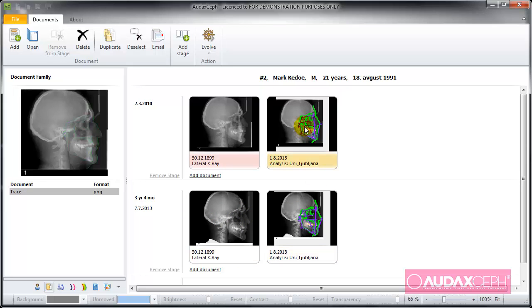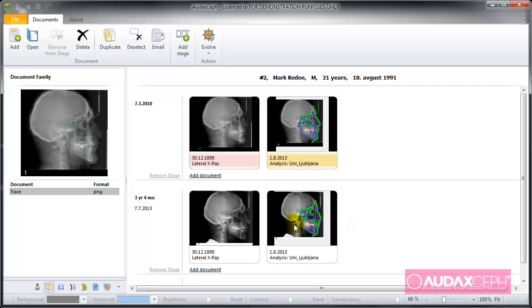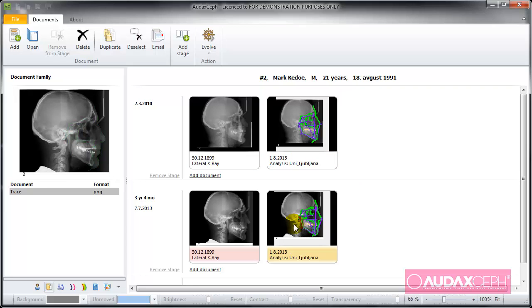So what I can do now is push the Evolve button here and go directly to the superimposition environment. Or I can click with the right mouse button and go to the superimposition option. I can also drag the superimposition on top of the first superimposition and wait for the result.